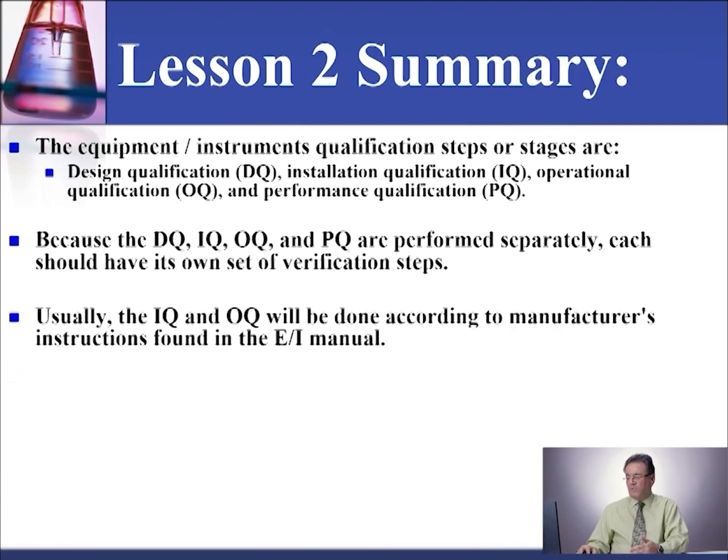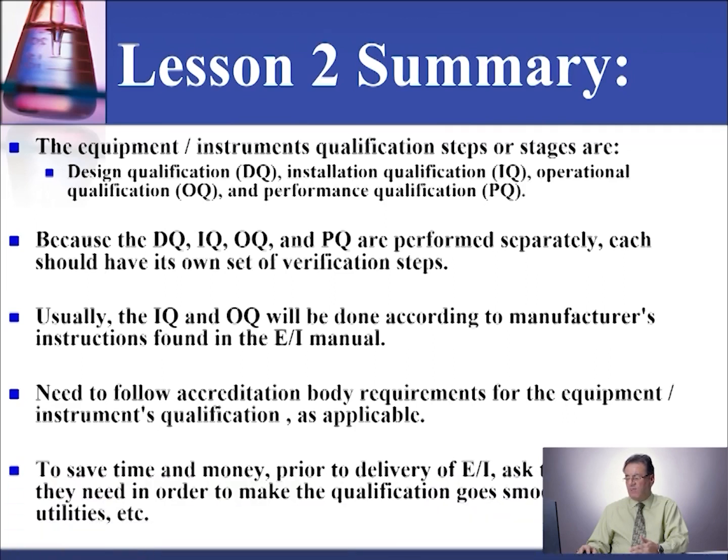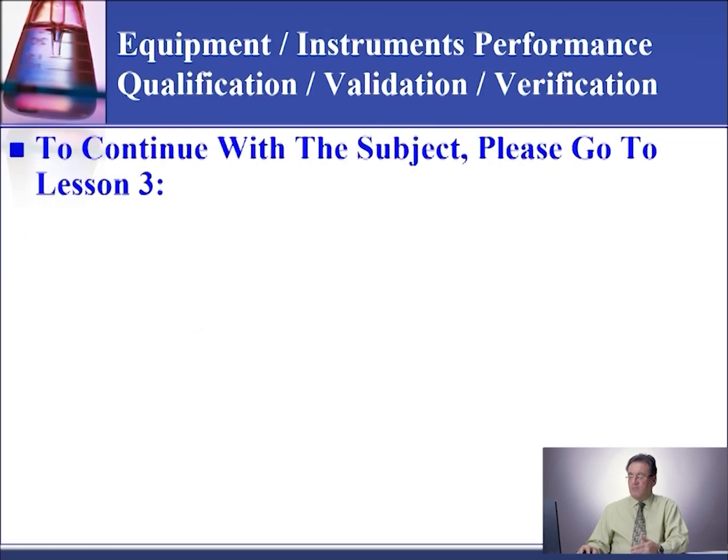Any deviation observed during the qualification steps or from the purchase order should be recorded, investigated, and solved before you move on to the next phase or stage or release the equipment or instrument for patient use. You need technical SOPs for the new equipment or instrument as applicable. Do not confuse test validation and verification with equipment or instrument validation, verification, and performance. The test validation and verification is part of the equipment or instrument verification.